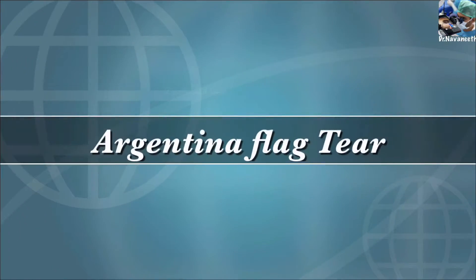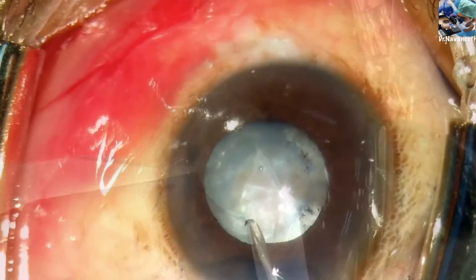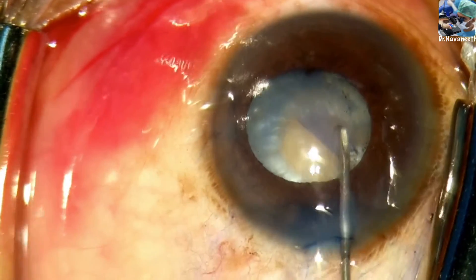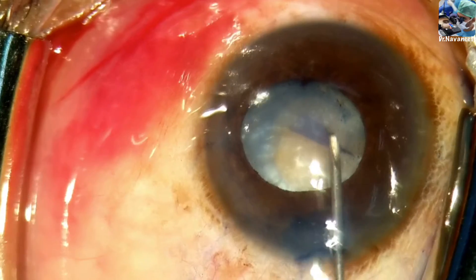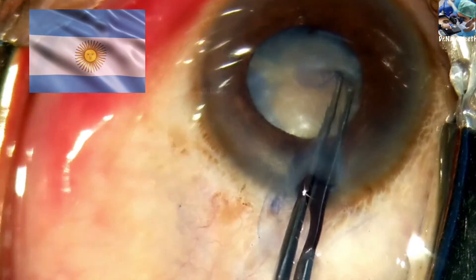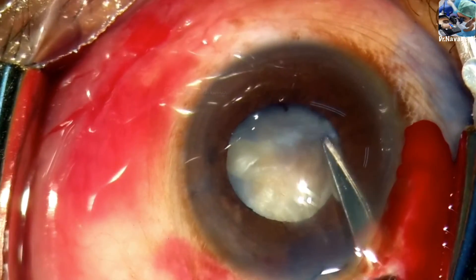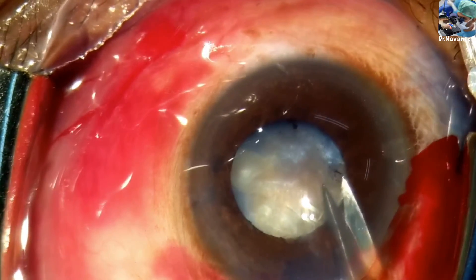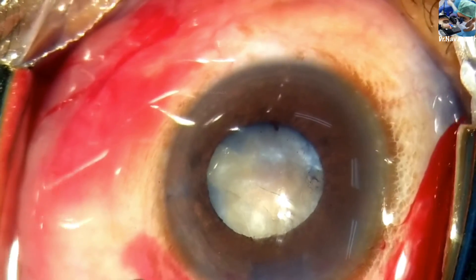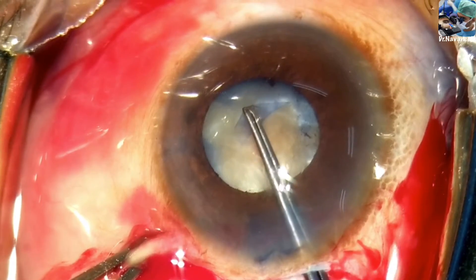This is a case of intumescent cataract with posterior pressure and a weaker zonule. On attempting to pull the rhexis flap, capsular tears are noted on both sides, leading to an Argentina flag sign — a typical blue-white and blue zone pattern. Tangential cuts are given with Vannas scissors on both sides of the tear, and the flap is expanded on both sides.